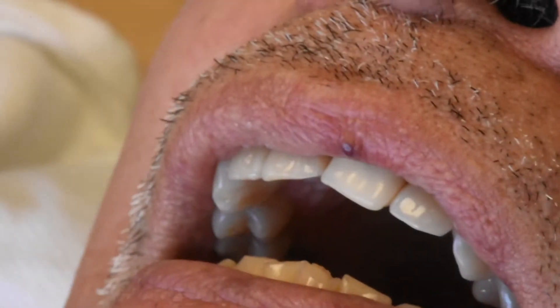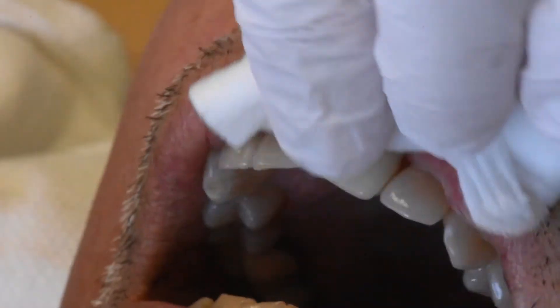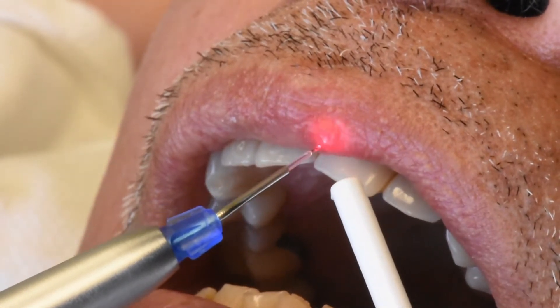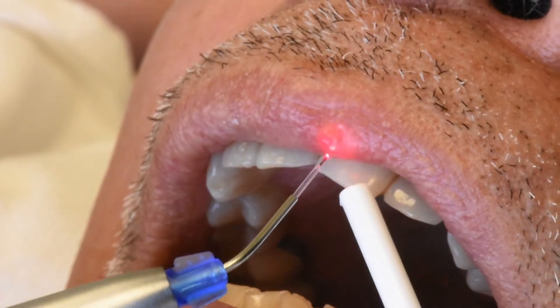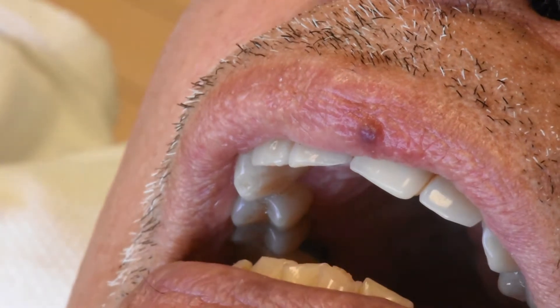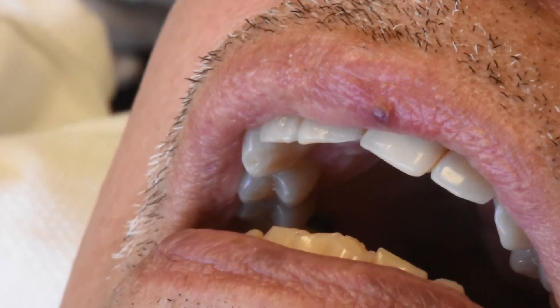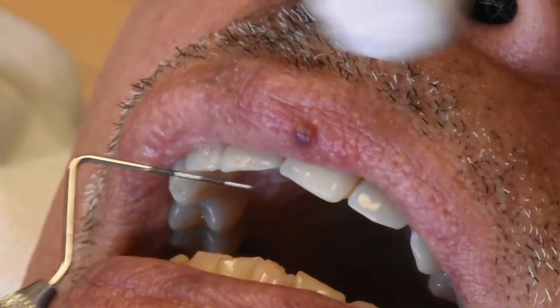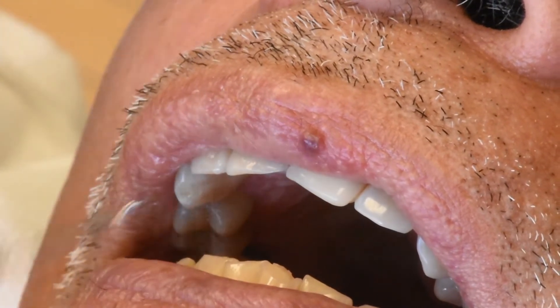Although this is really not wet — if you can wet it, please. Sometimes we need to repeat this procedure. We're going to put a little bit of ozone oil on this side. Right now we can see it's whiter in color and it's about three millimeters in diameter.